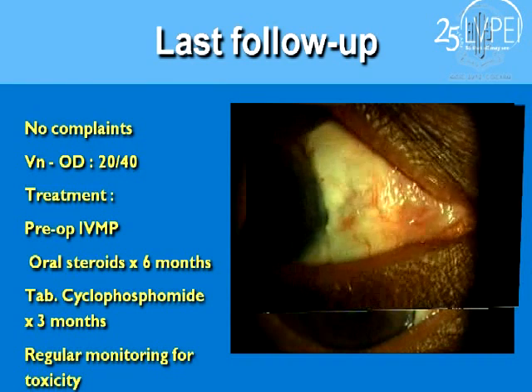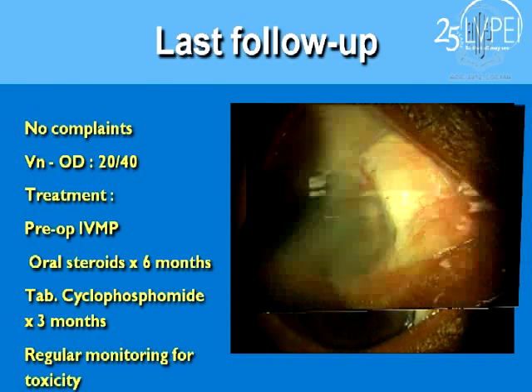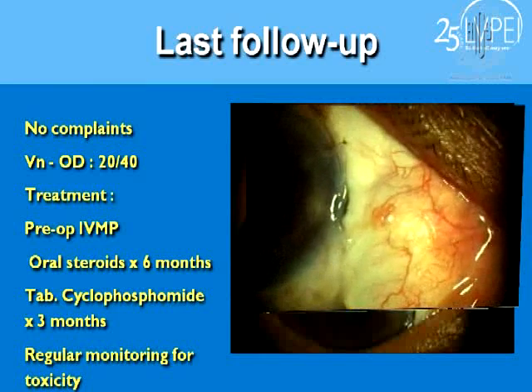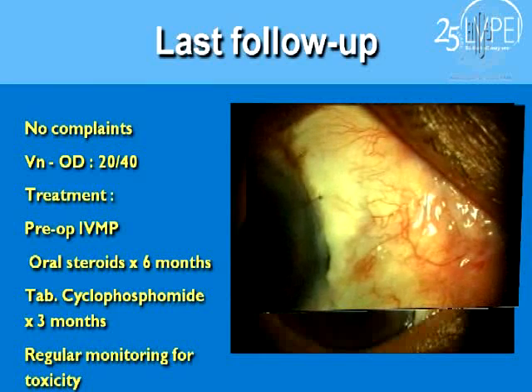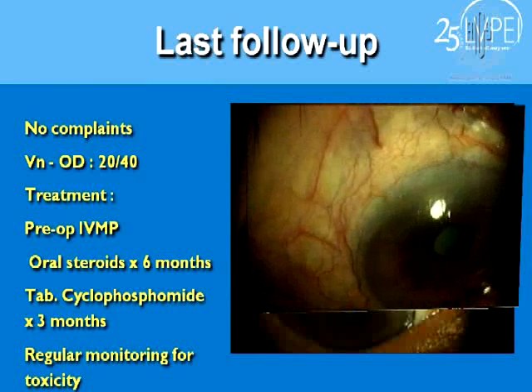The patient a year later also underwent cataract surgery. You can see how well the graft has taken up. The tissue is well epithelialized with conjunctiva, and the blood vessels have once again repopulated this area. So this was a case of successful treatment for us.